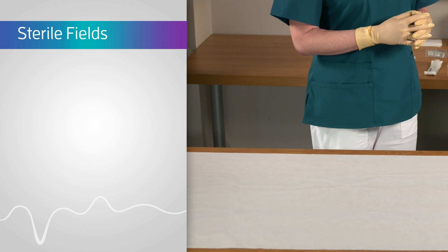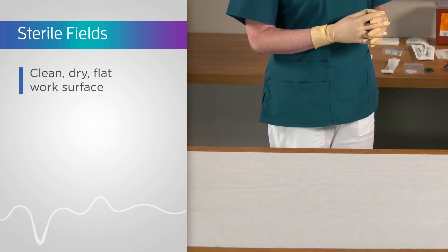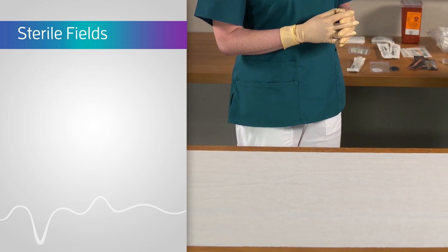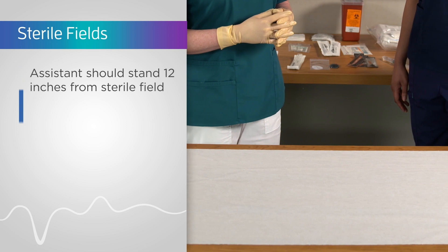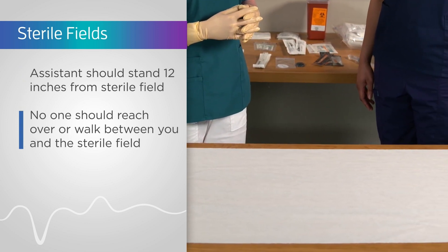Begin by preparing your sterile field on a clean, dry, flat work surface. A Mayo stand or clean desktop in a clinic works well. Your assistant should stand about 12 inches from where the sterile field is being set up. Once established, no one should reach over or walk between you and the sterile field.